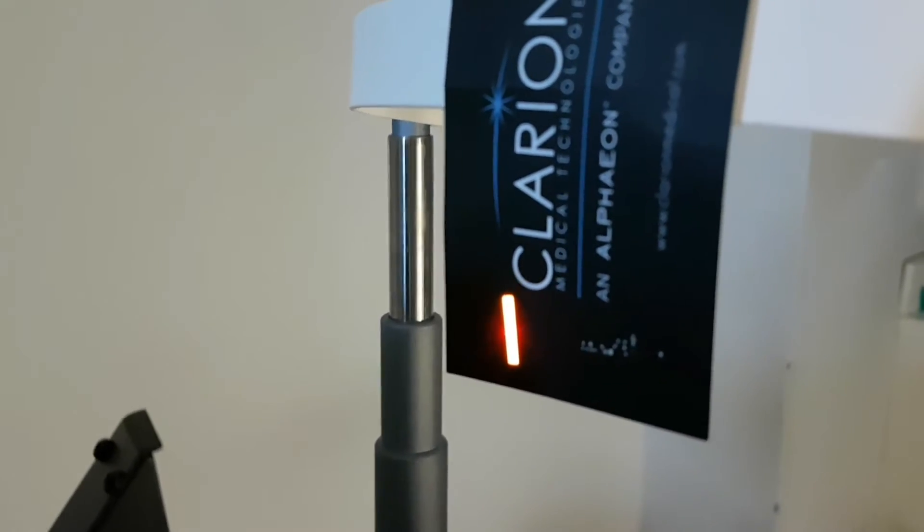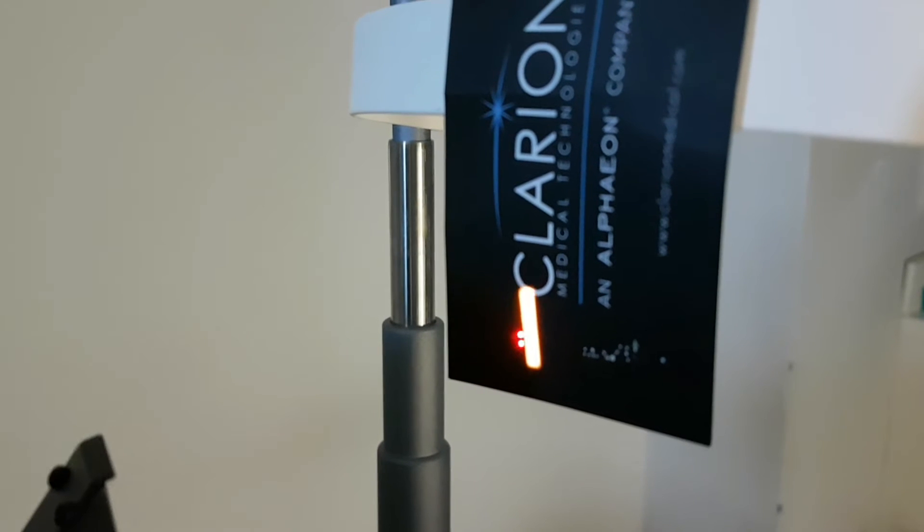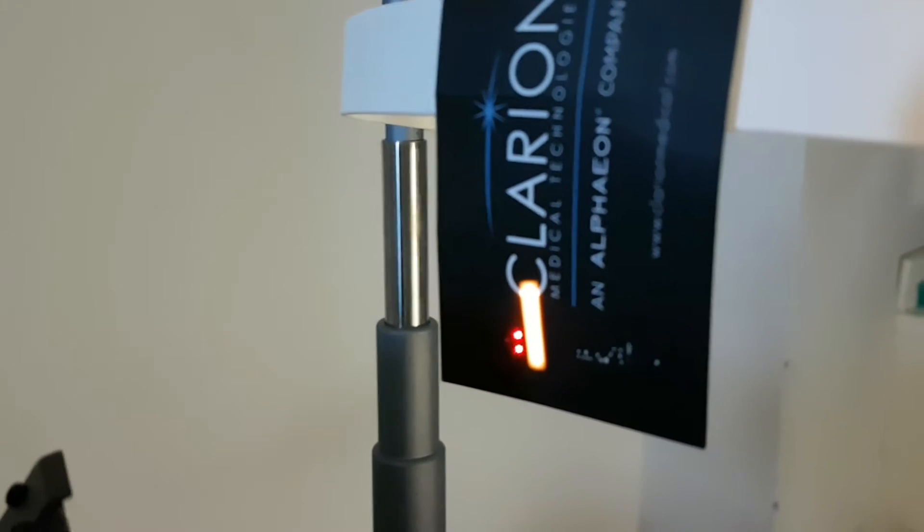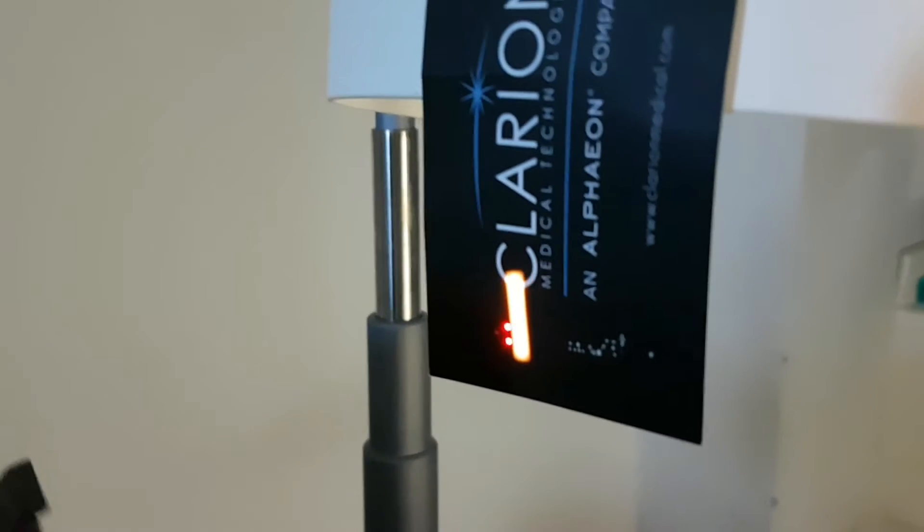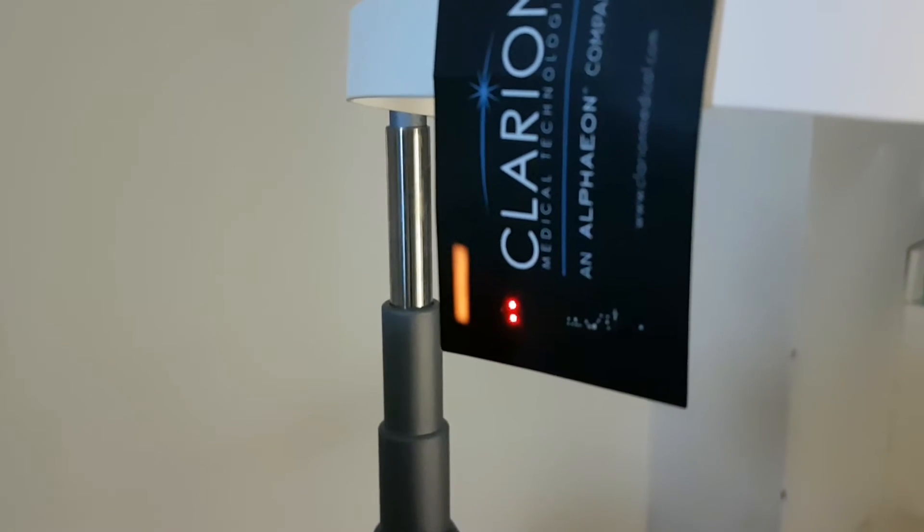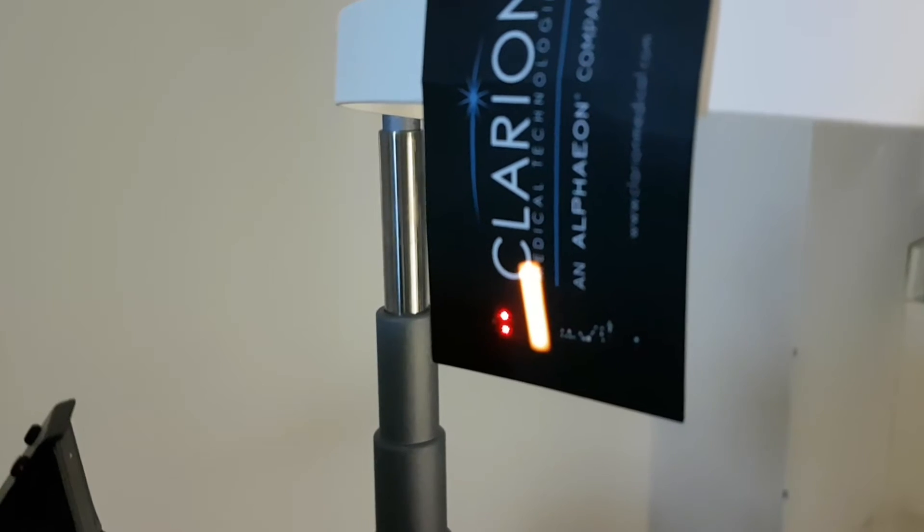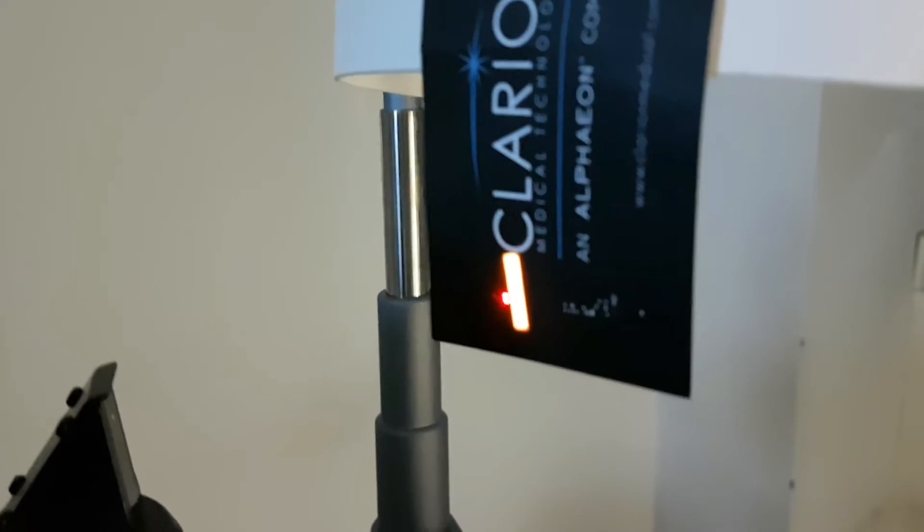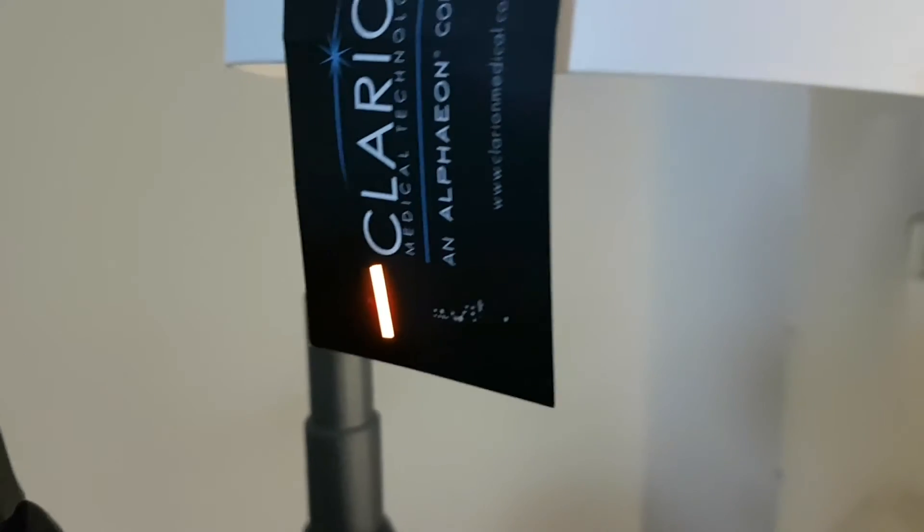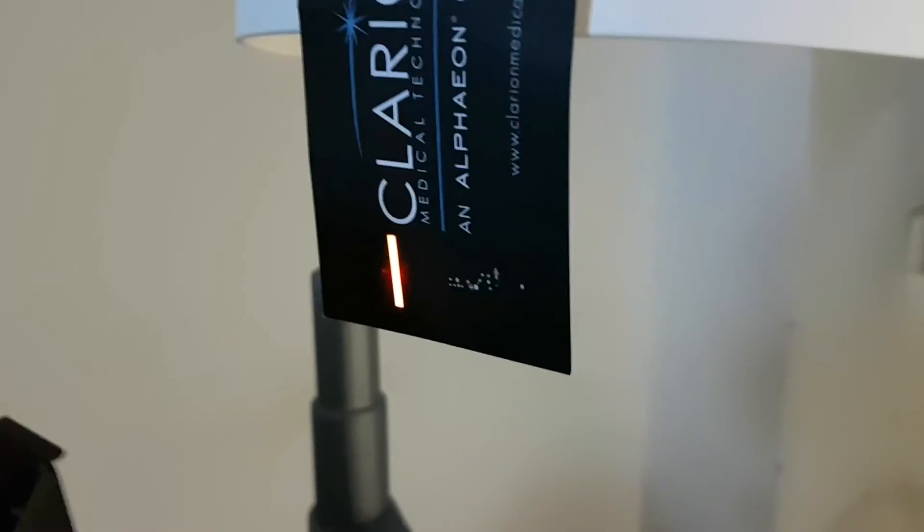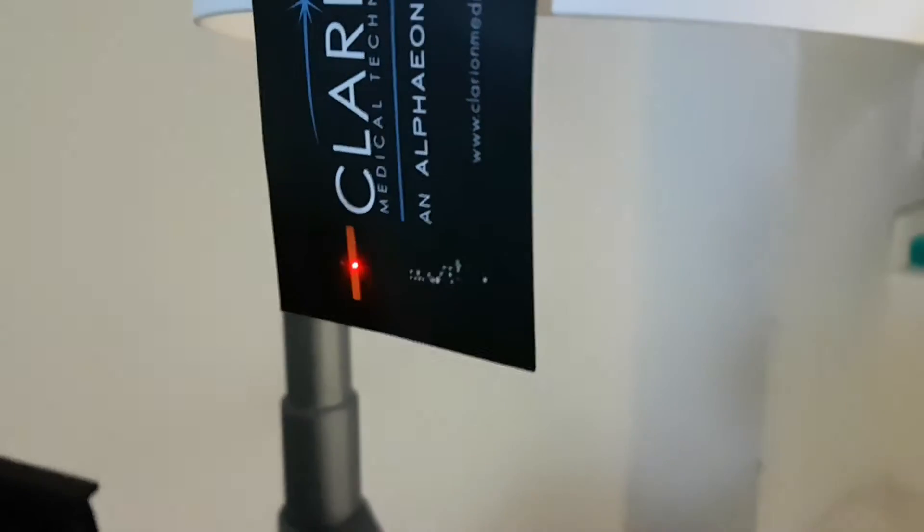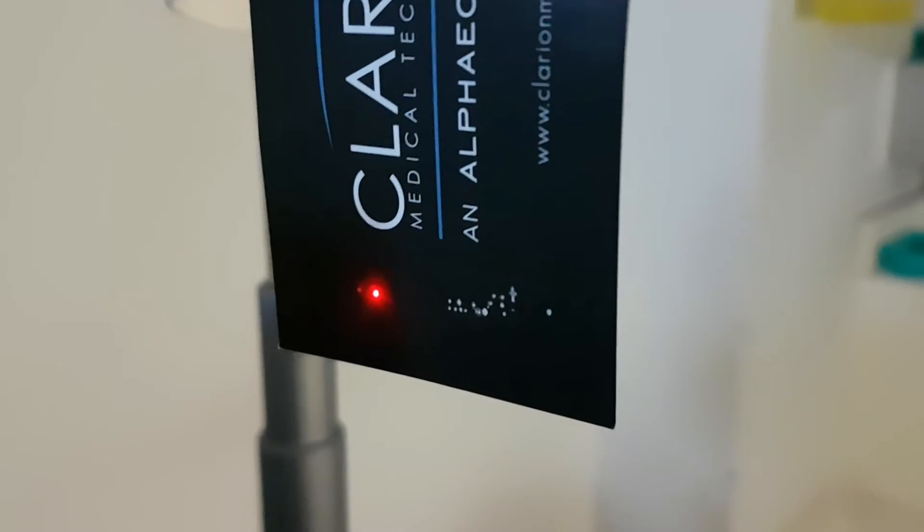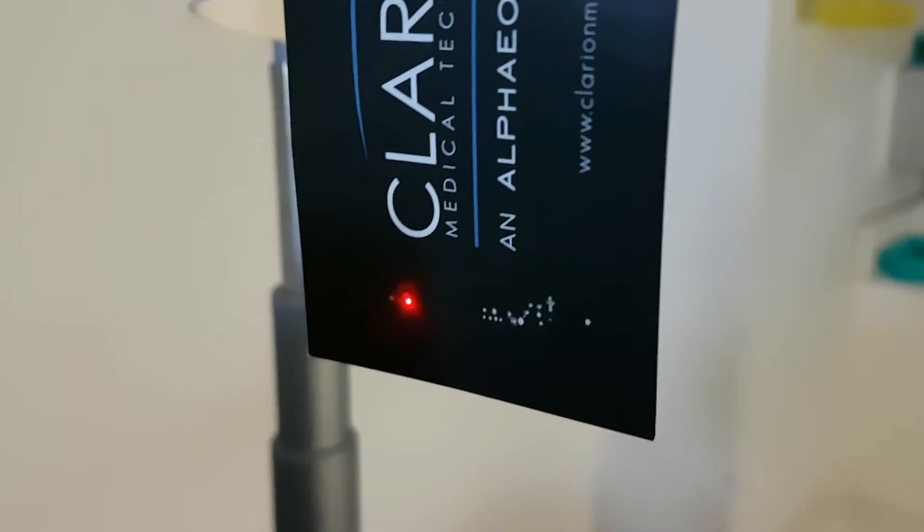So of course you have two red dots. You can see the two dots. You're in focus when the two red dots come together. When the two red dots come together, you're in focus.